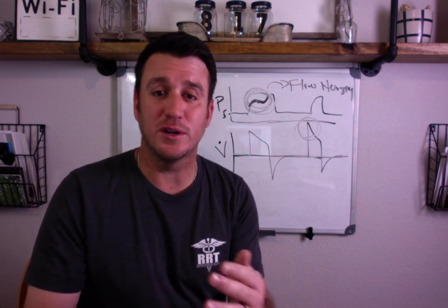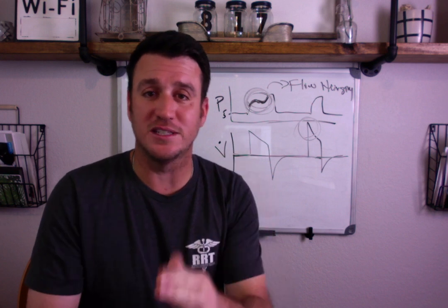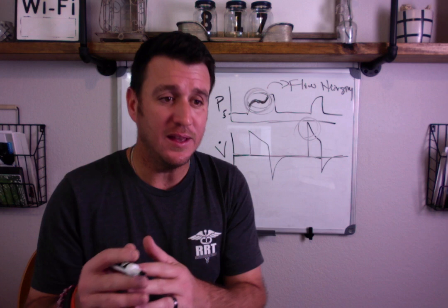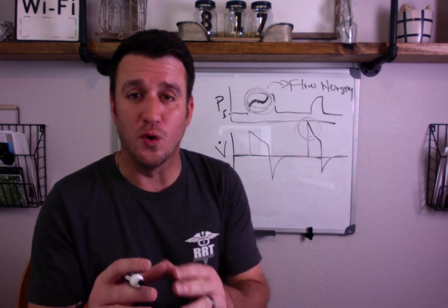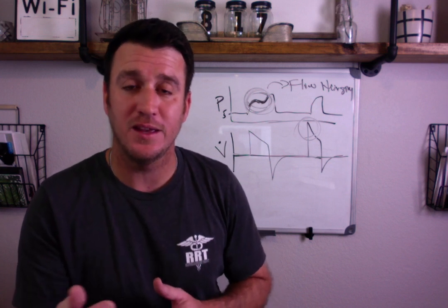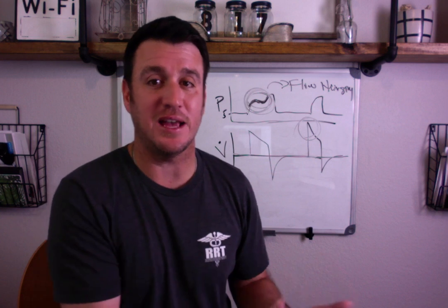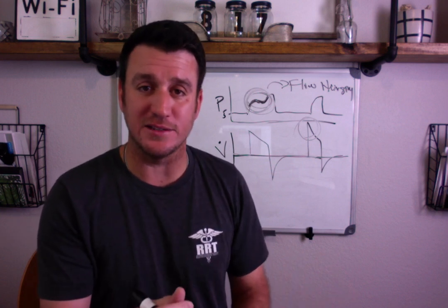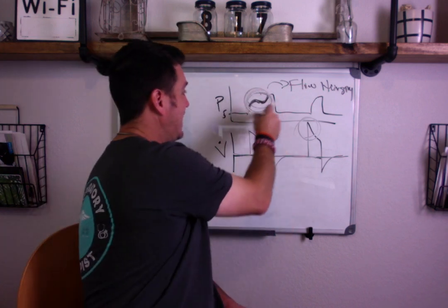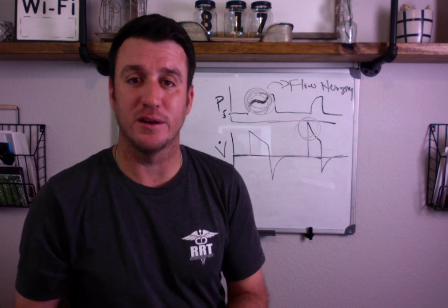I understand that you understand that normal flows, excuse me, are 40 to 60 liters per minute, higher for COPDers. I get that. It doesn't mean that normal means normal for everyone. You got to step outside the norm sometimes and do what the patient is asking you to do. They can't verbalize it. They can only give you data to operate off of. And if this is the data you're getting, then make an adjustment and do something different.